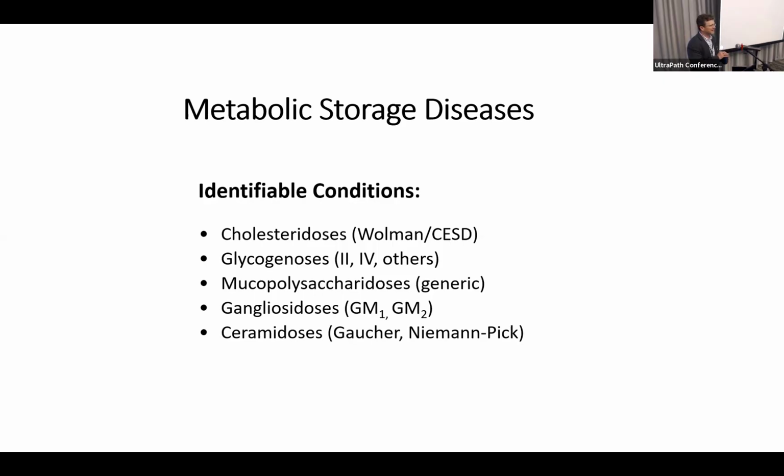So I guess in your case, being in a pediatric hospital, they're sensitive to sending you properly fixed specimens to work on, or do you have the problem of having to go to paraffin all the time? It's a constant ongoing training process, I would say, for our residents and our fellows, and they're aware that we have a very active electron microscopy lab, so they're pretty good about giving us tissue in glutaraldehyde right off the bat.